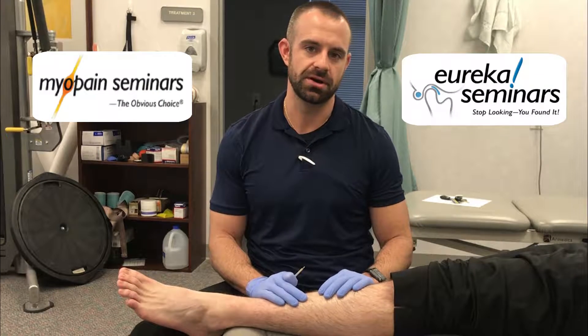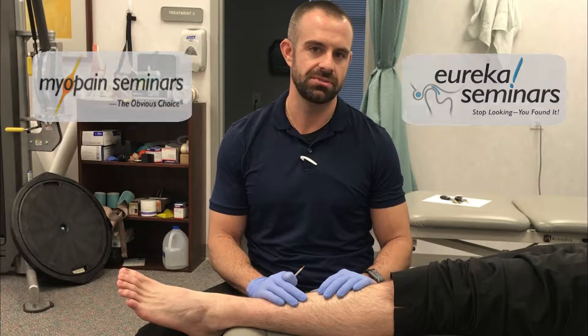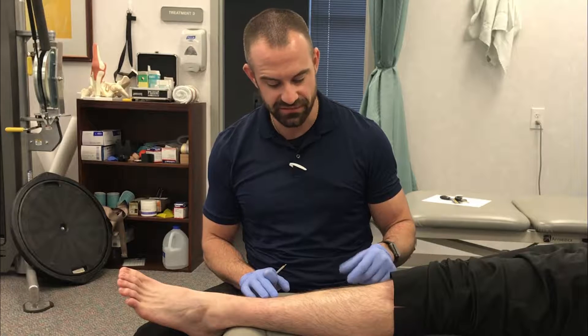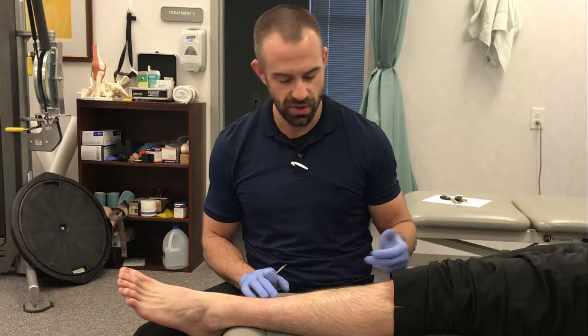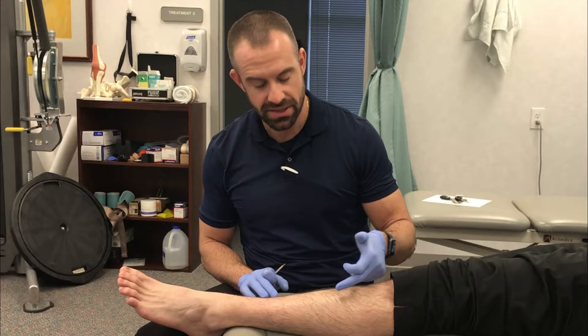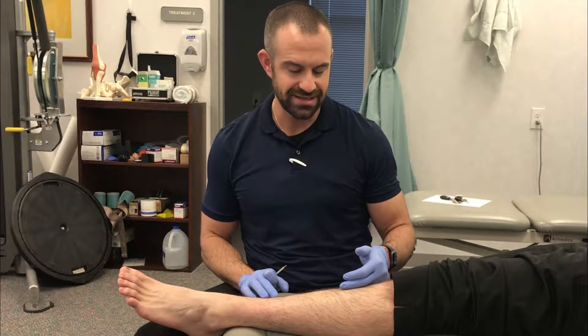Hey, Will Ferris with Myopain Eureka Seminars. One way I like to use electrical stimulation with dry needling is to help verify my needle position. Here in the anterior lateral portion of the leg, it can sometimes be difficult to make sure that you're actually in the right muscle. You've got your anterior tibialis, your extensor digitorum longus, and your extensor hallucis longus, and since they're right next to each other, sometimes that can be difficult to differentiate.